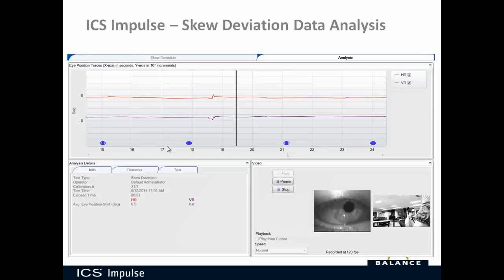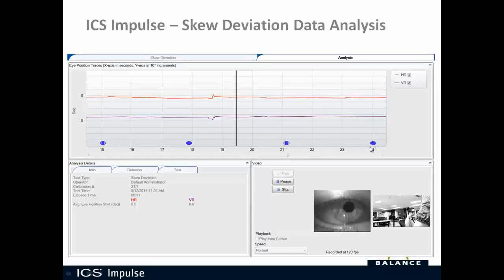Regarding data analysis, this data is from a subject with normal results. Red is the horizontal eye position trace and purple is the vertical eye position trace. Down at the bottom, a blue open eye icon indicates uncovered, and a solid eye indicates covered. For a normal person you basically get a flat line — you don't see any eye shift. Here her average eye position shift was 0.5 and 0.6 degrees. In an abnormal person you would see the eye actually move when you cover and uncover the left eye.